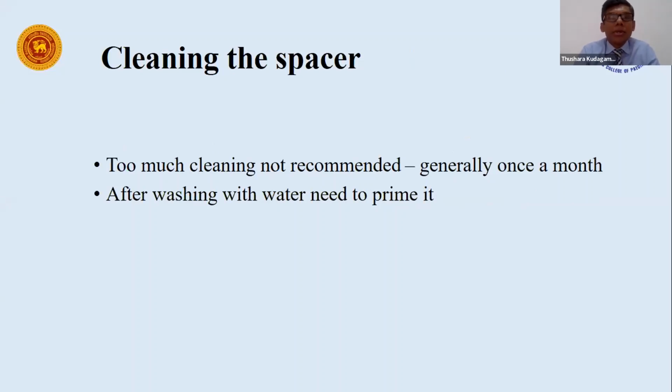Then the other question is about cleaning the spacer. Now, we have heard earlier, when you wash the spacer device, you are generating electrostatic charges, and you have to prime it before you use it. Because of that, you don't have to clean the spacer very often. Most will recommend cleaning it once a month, unless it has really too much muck. And again, it's very important that you prime it before you use it again.